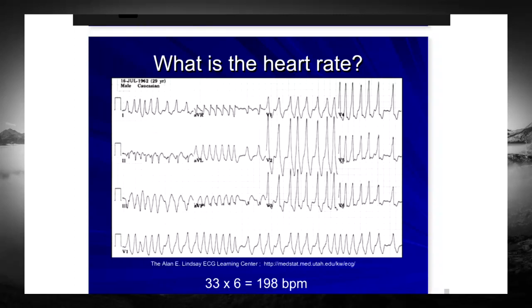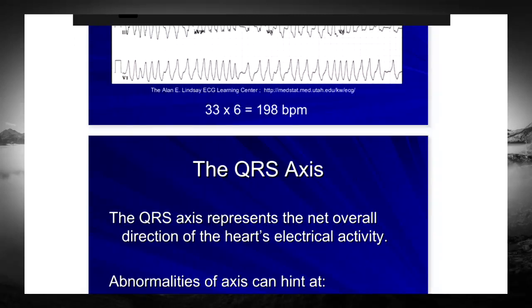Can I actually see P waves in this? When you slow it down, you'll be able to see, oh, there's a P wave, there's a QRS. So now I know this is actually sinus tachycardia and not this baby having SVT or some form of SVT. So that's why you would do it. Usually you do that on your own, but if you come upon something that somebody else did, you still want to make sure that it's standard. So that's what that box is for.